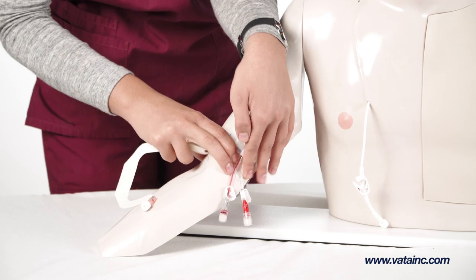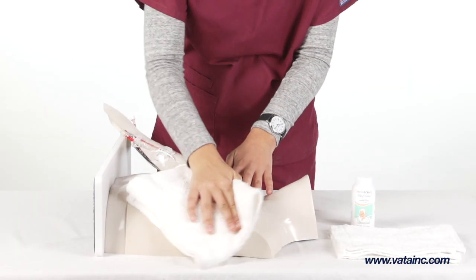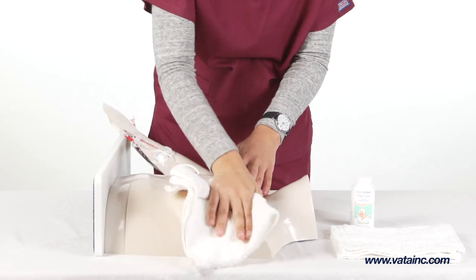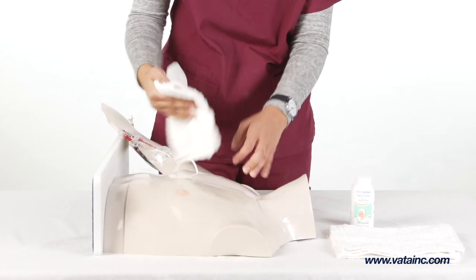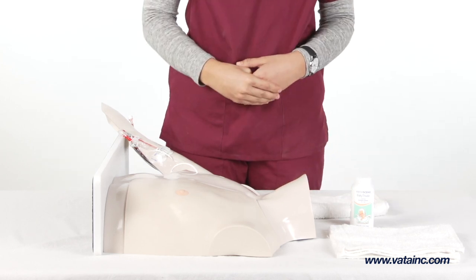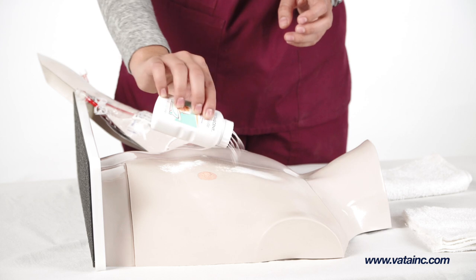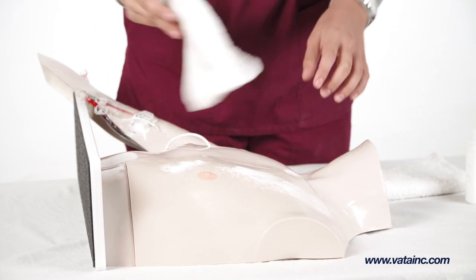With repeated use, the chest tissue flap may need to be cleaned. To best perform this, use a clean towel and either warm soapy water or isopropyl alcohol. Wipe the pad until clean and allow to fully dry. Sprinkle cornstarch baby talc onto the flap and using a clean dry cloth wipe off any excess.